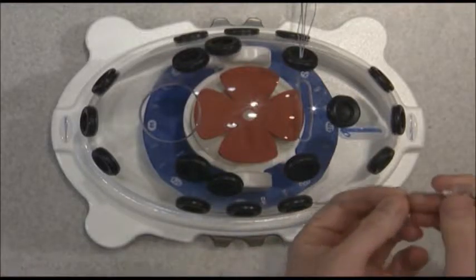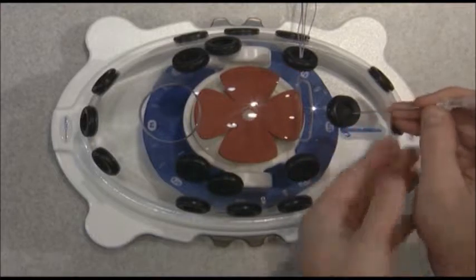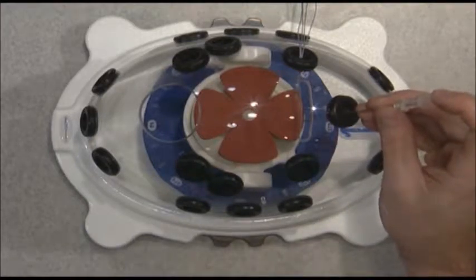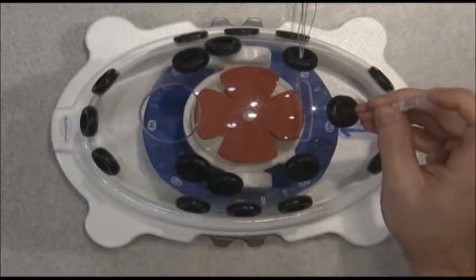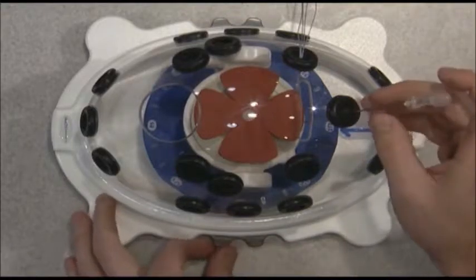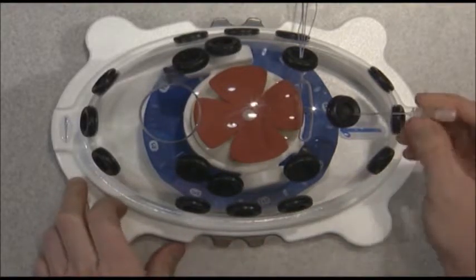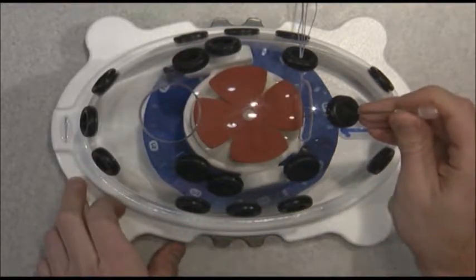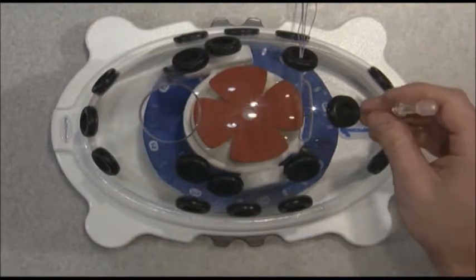And now I'm going to triangulate for our more posterior anchor. So this one, you can see if I tried to put this in, it would probably impinge upon that hole for the previous anchor. So we take the dial on the fast workstation and give it 1 click. Now you can see that that anchor is about a centimeter apart and in a different part of the rotator cuff, giving us good spacing.